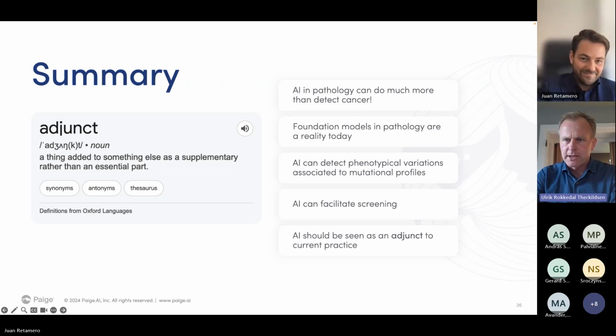Great. And then one comment or question from Maxim here. He's saying probably we'll also need a new terminology for HER2 test result. As for now, positive, negative is used, based on amplified, non-amplified status.